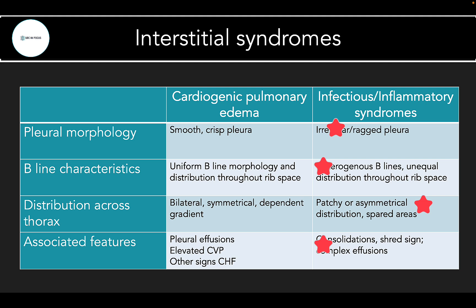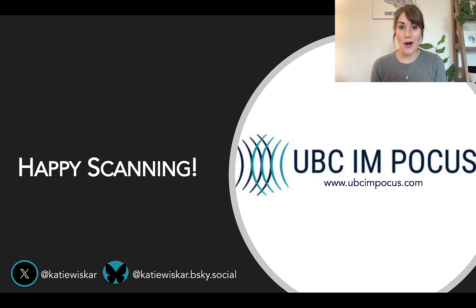Putting this case together: pleural morphology was mixed — some smooth areas on the right, but definite irregularity especially on the left. B-line characteristics were likewise mixed — uniform in the right upper chest but more disparate elsewhere. Distribution was clearly asymmetrical with a greater burden on the right, and skipped areas with A-lines on the left. Associated features included small bilateral shred signs and effusions. Together, this is not pure cardiogenic pulmonary edema — there's an infectious or inflammatory etiology at play. Clinical history and other POCUS findings would help complete the picture. Hopefully this helps you get more out of your lung ultrasound. Visit us at UBCIM POCUS for more screencasts, and happy scanning!